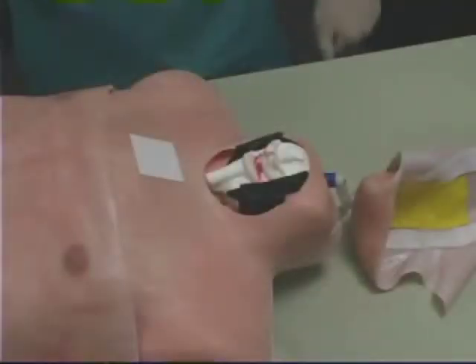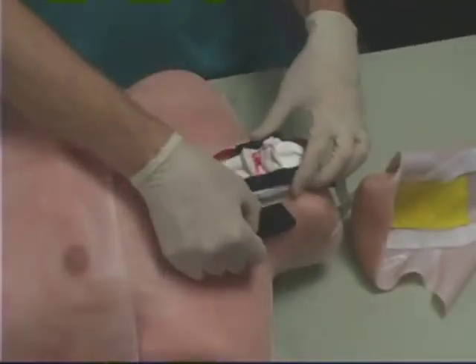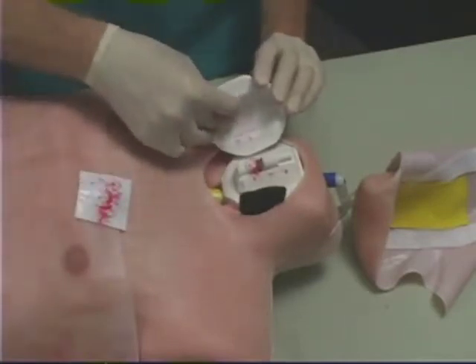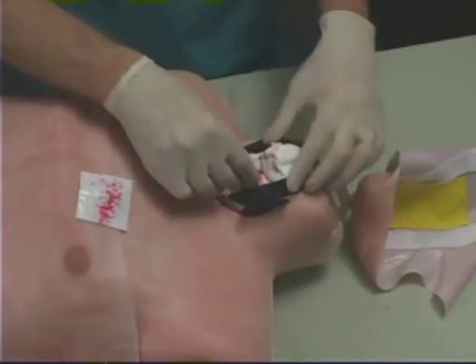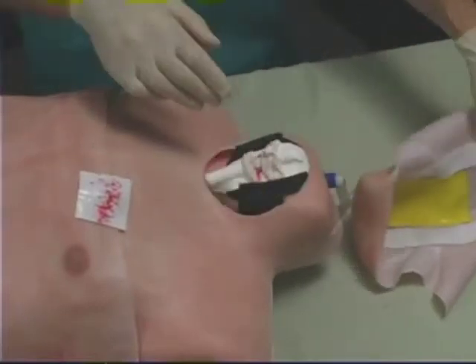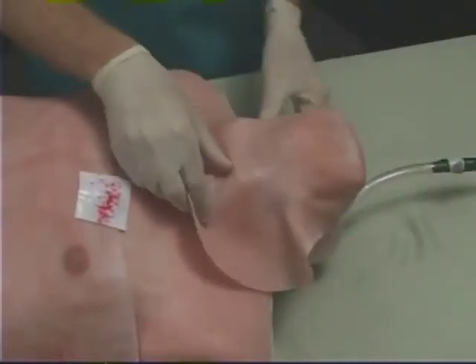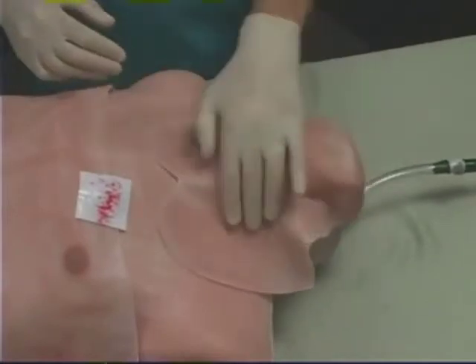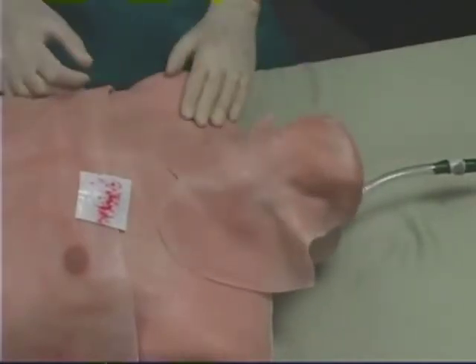The cricothyroid membrane is designed for surgical or needle dissection, not blunt dissection, and the membrane must be replaced after each surgical dissection procedure. For the second student, replace the cricothyroid membrane and then adjust the replaceable neck tissue by simply moving the neck tissue slightly higher up on the model so an uncut area is over the incision site.